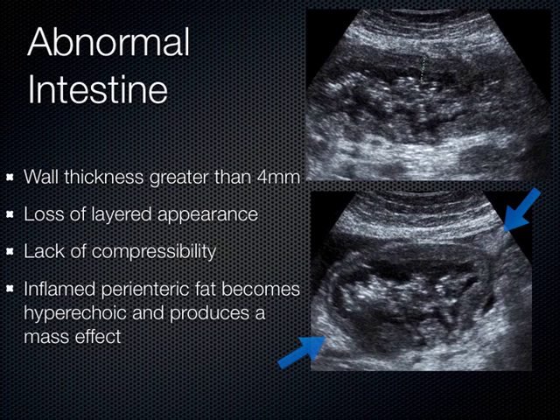And when I compress it, it exhibits this mass effect. It all kind of moves together as one unit. Now, intestines should easily flop around each other and slip around each other and should slide amongst one another. When there's inflammation or abnormality there, then it all moves together like a unit. And this is an example here of a patient who had pseudomembranous colitis.